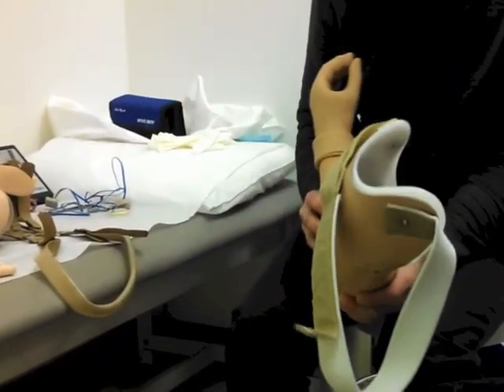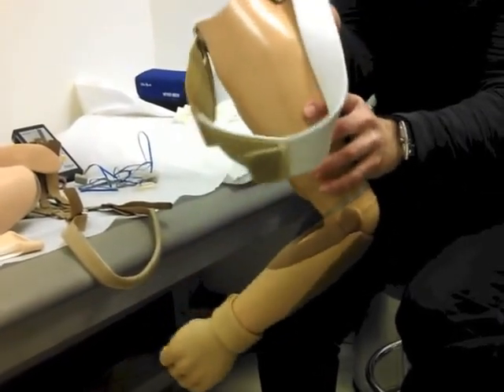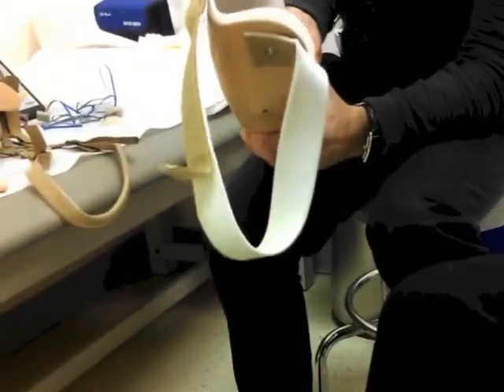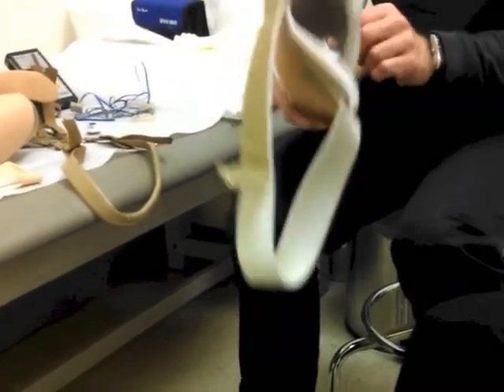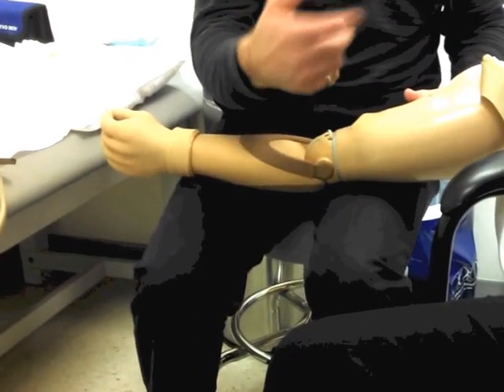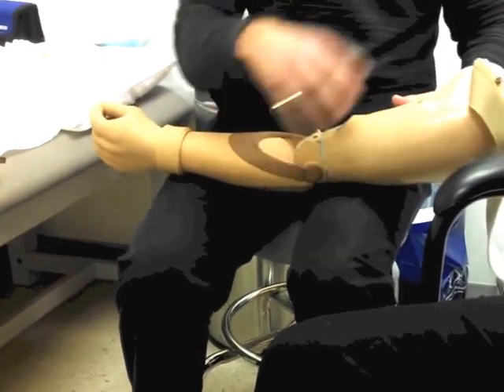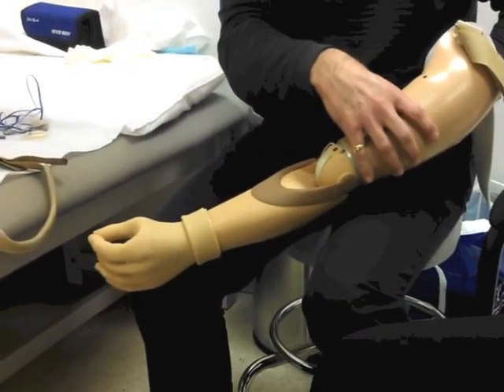This is what we call a suction socket — it has a valve here. What I've done in the past with patients with this type is you cast them, you make a mold of the limb. What you get is what we call a donning bag. You put it on your arm, pull the end through, put your arm in, and pull yourself through it — pulling the soft tissue into the socket, suspending and locking yourself inside.